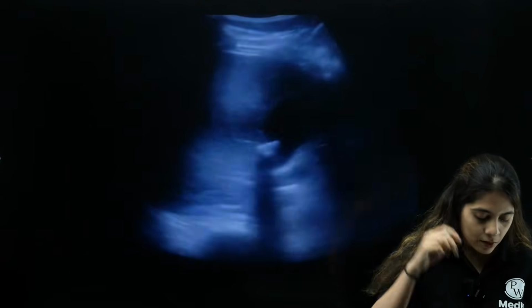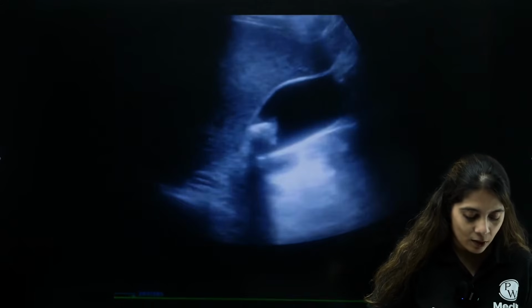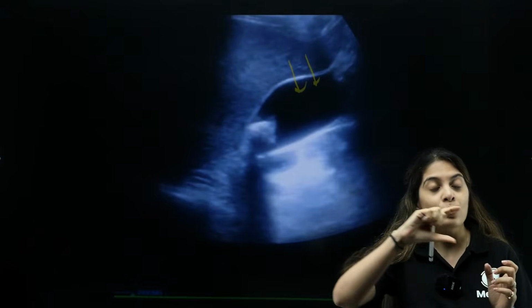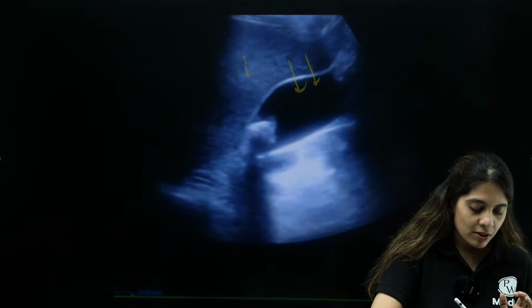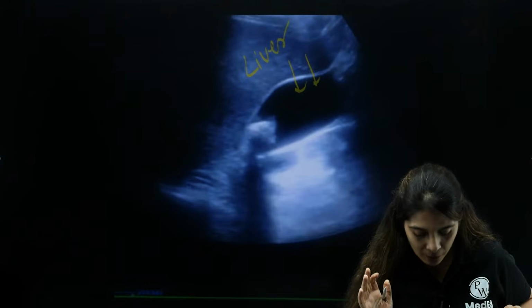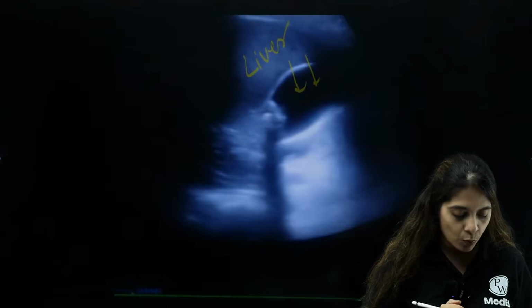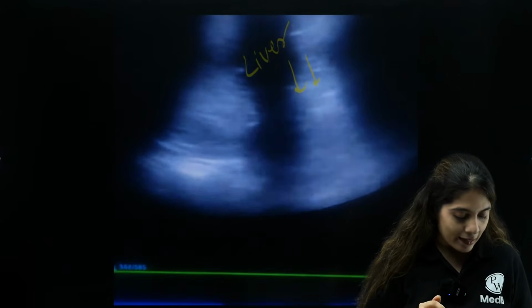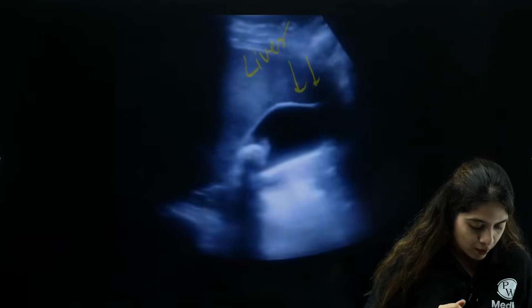Okay. So what you are seeing over here is, first of all, you need to identify how the gallbladder looks. The gallbladder looks like this, right? This is a normal gallbladder. It looks like an anechoic, bag-like structure, and this structure over here is your liver. So it is very important you identify the gallbladder. Now once you have identified it, I am playing this video again. You see some hyperechoic areas present in the gallbladder, right? Now what are these hyperechoic areas? I am going to replay this and then pause it for you.